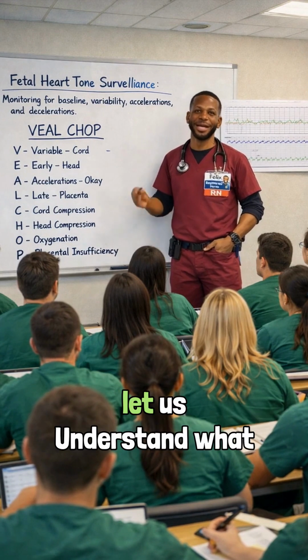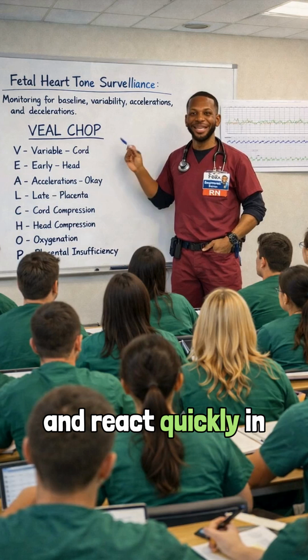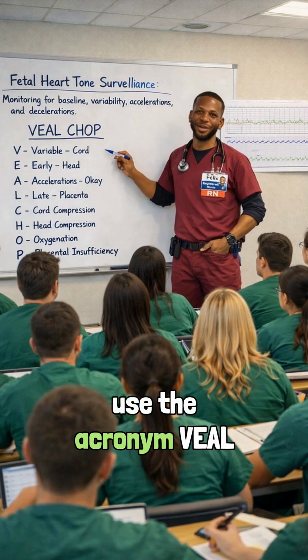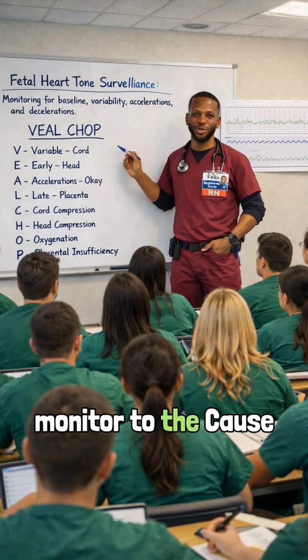Moving along, now let us understand what Veal-CHOP is. To help you memorize and react quickly in a high-stress environment, we use the acronym Veal-CHOP. This links the pattern we see on the monitor to the cause of that pattern.